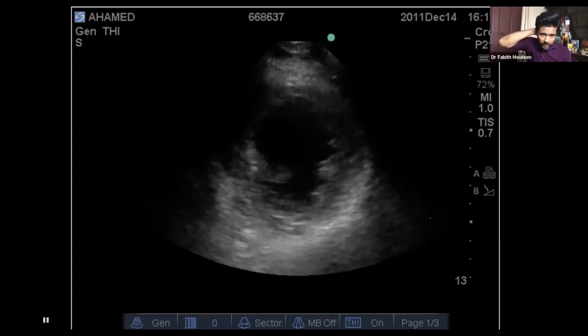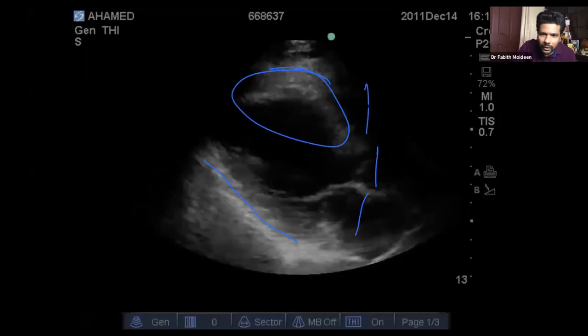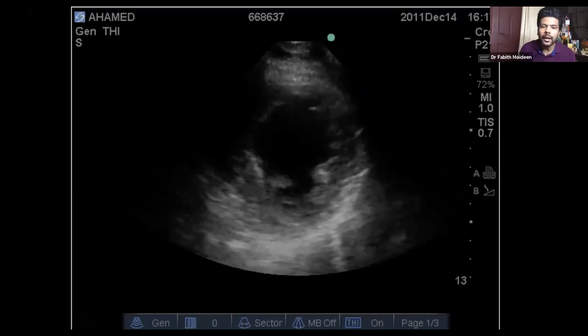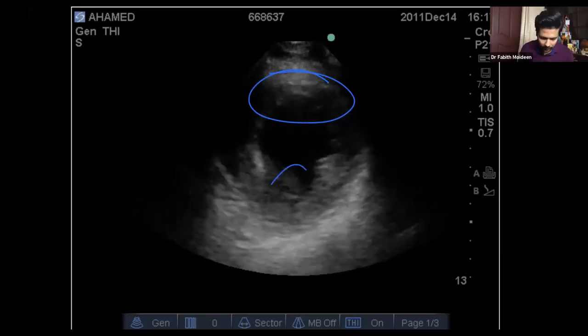Okay, so pulmonary embolism, there is no RV dilatation there in that parasternal long axis. You can see the RV here, it's very small. You cannot comment on RV pulmonary embolism there. And again, in short axis, you can nicely see that this part is not moving. That's the anterior part of the LV is not moving when you compare with this part, and this part, right?